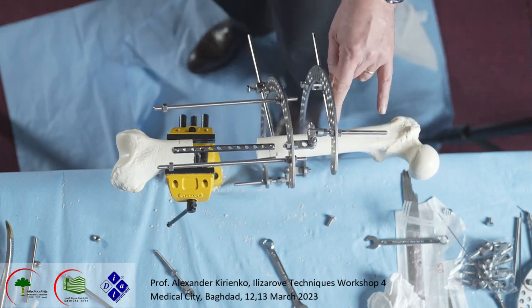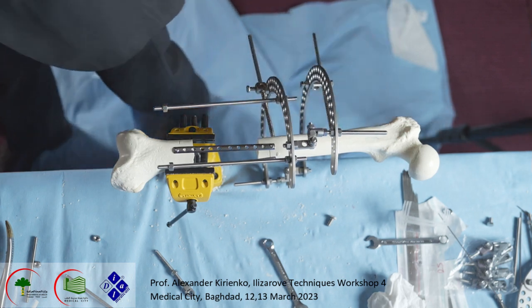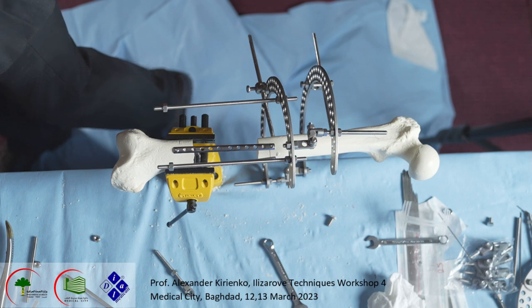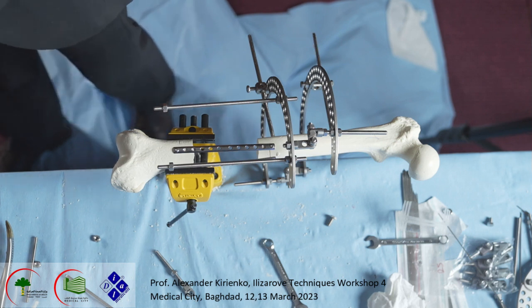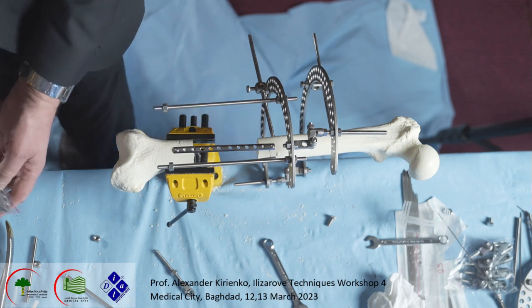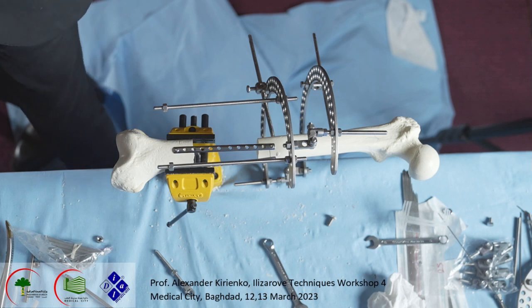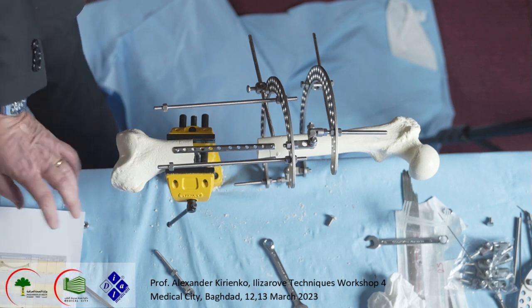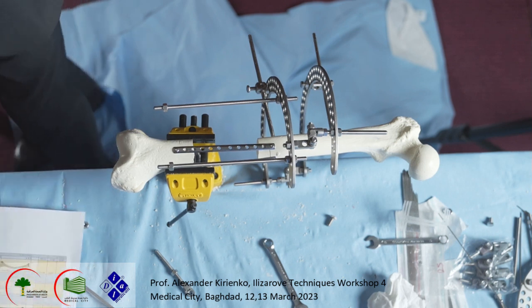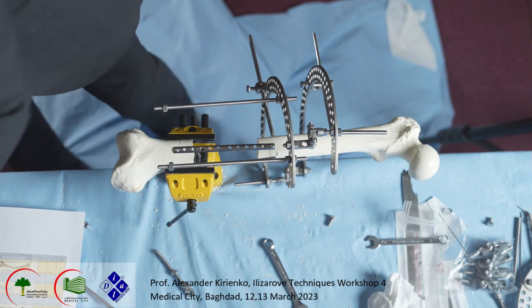we like explain you, this fragment, the proximal fragment, should be really stable during lengthening. And what we may do here, like I explained before, we may use some kind of arch. We don't have this arch now. We have this system for inclination, or we may put la placca curva.